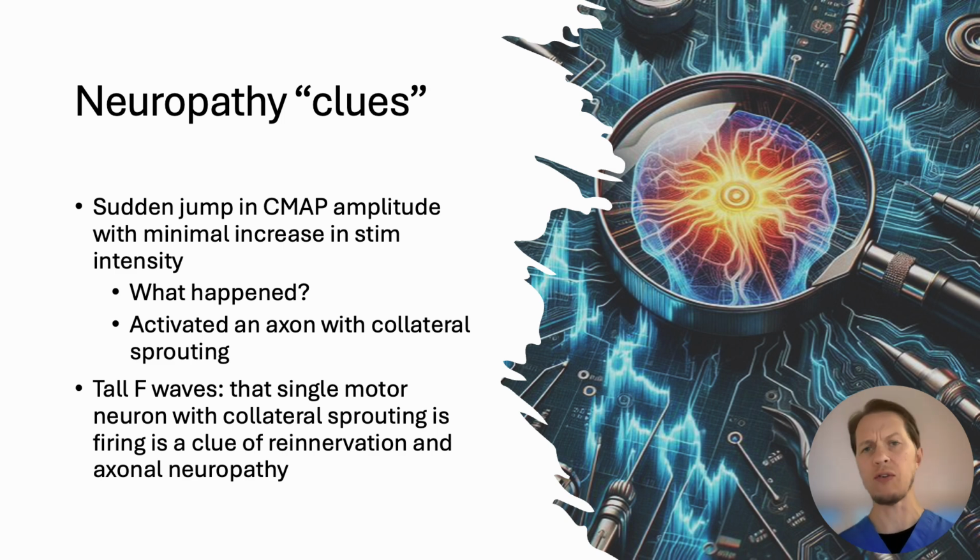Sometimes it's such bad neuropathy that there's just poor responses, not very reliable response. There's a lot of dropout. Sometimes you get one, sometimes you don't. So you've got to just keep on stimulating, and eventually you can't stimulate extensively. You just gotta move on. But if you happen to catch that, good clue of neuropathy.